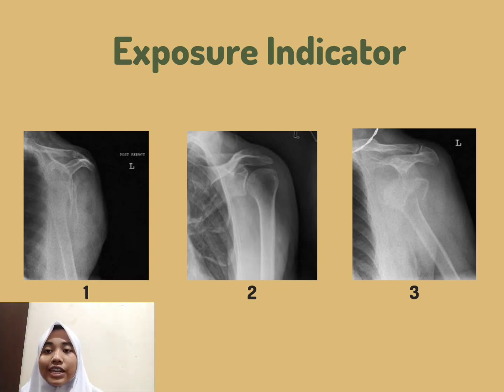In the exposure indicator, we know about the underexposure and overexposure. An underexposed radiograph means there was less penetration of the X-ray beam through the patient's tissues.